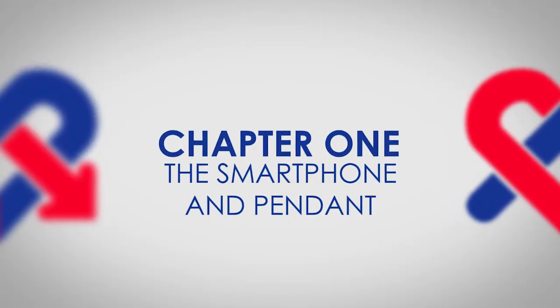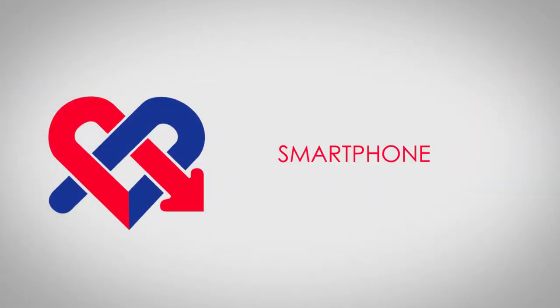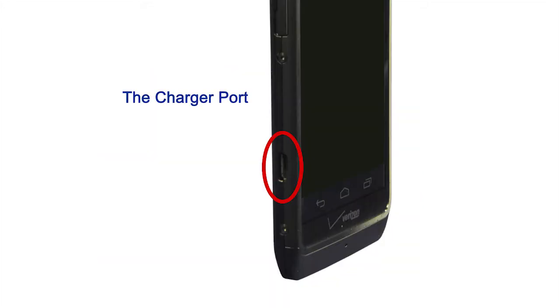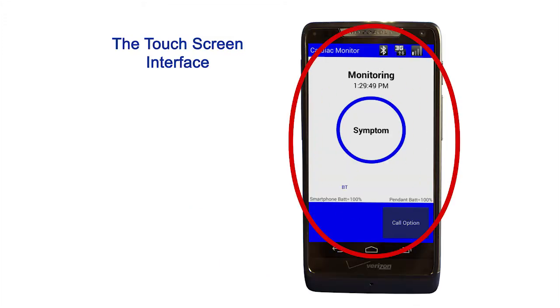Chapter 1: The Smartphone and Pendant. Let's first become familiar with the Medicom smartphone. There are a few buttons and indicators on the Medicom smartphone that you will use throughout your procedure: the power button, the charging light, the charger port, the microphone, and the touch screen interface.